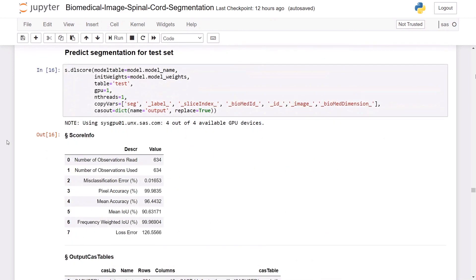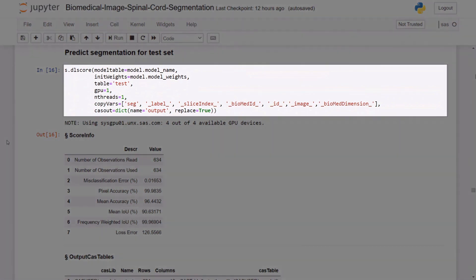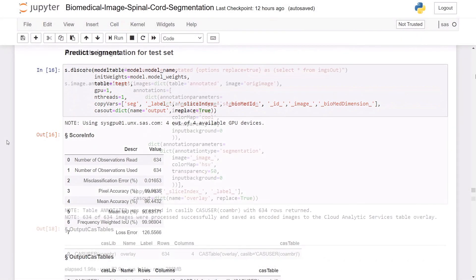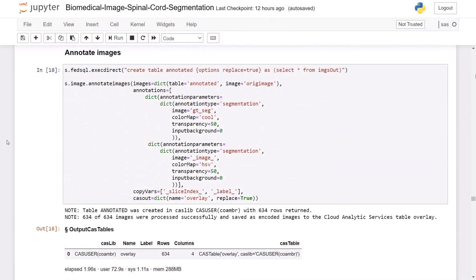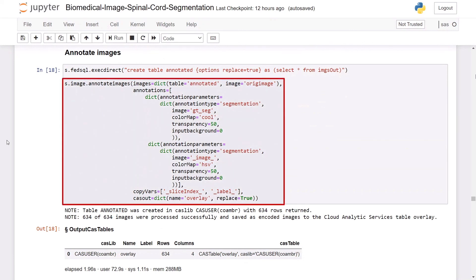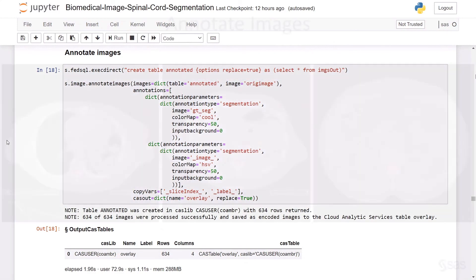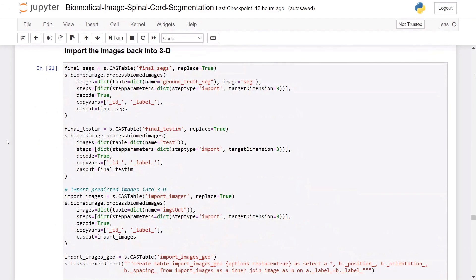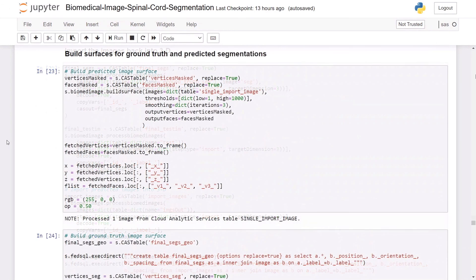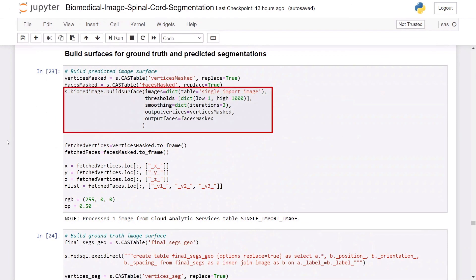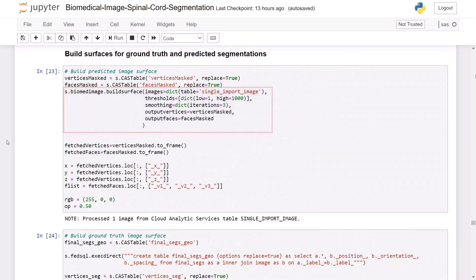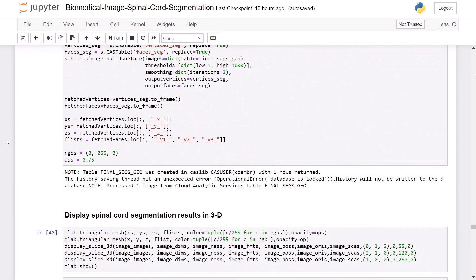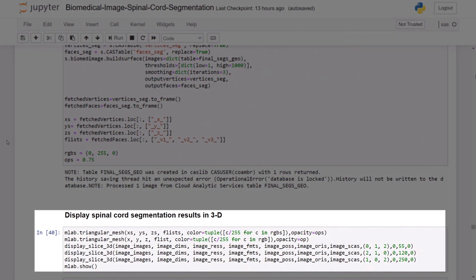When training is complete, it's time to evaluate how well the model actually learned. I'm going to score the model with test images that the model has never seen before. Let's now visualize the results that the model has predicted. I can use the annotate images action to overlay my segmentation results on the original image. Here are the results: the red area is the predicted spinal cord region and the blue area is the ground truth region. To visualize these results in 3D, we'll first import the images back into 3D, then use the build surface action to build both the ground truth segmentation and the predicted segmentation region. These build surfaces are plotted on top of the original 3D image and can be displayed using the MiAVI software for visualization.